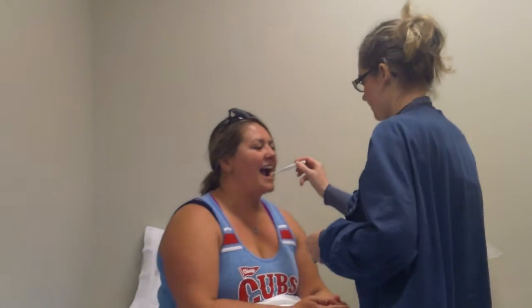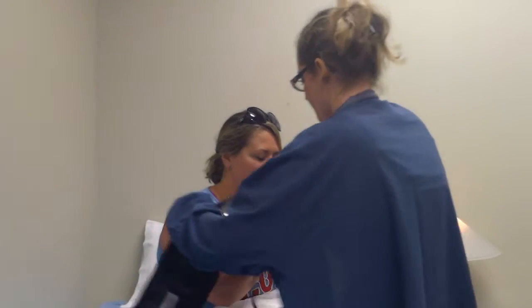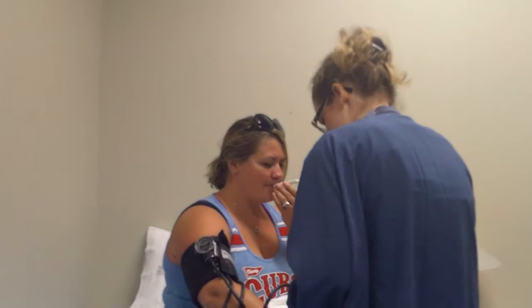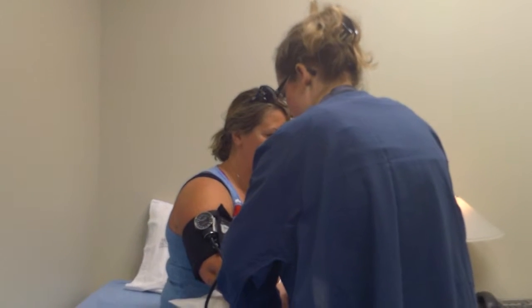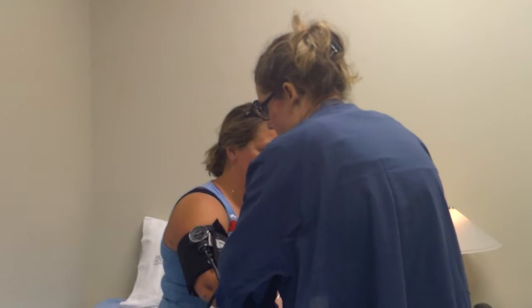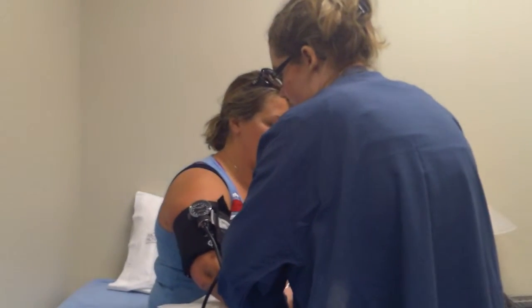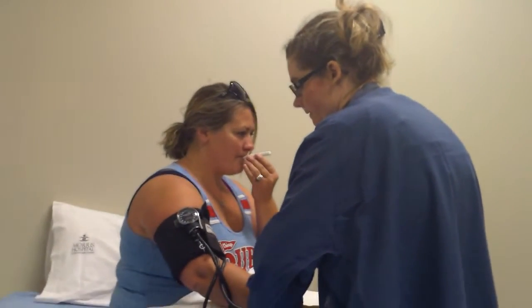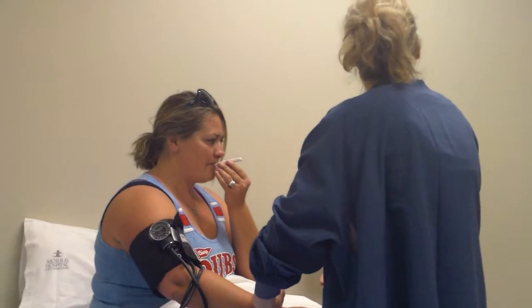Go ahead and you can hold them. First thing I'm going to do is grab your radial pulse, and I'm going to just check it as I pump this up. Okay, and I lose it at 100. I am going to check your pulse right now. We will count it for a full minute.